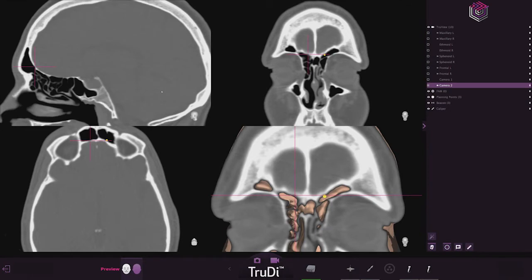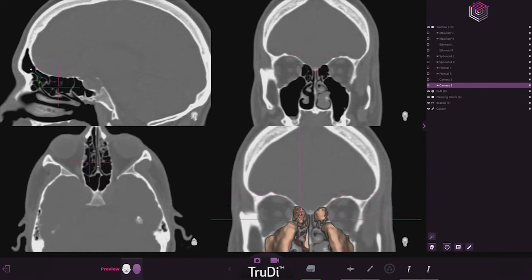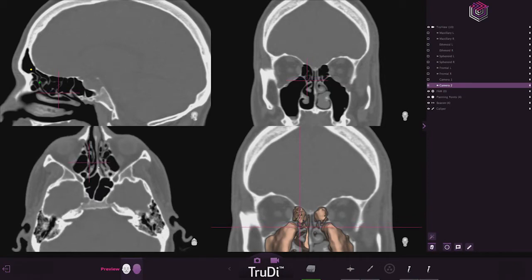And I'll just scroll through this. A little bit more to get exactly where I want to be. Okay, and to me this looks like the path. It's a little serpentine, but that's probably where we want to be. The left sphenoid, I will tell you, is a little suspect for me. That septal deformity is going to make it a little more challenging. So I'll go ahead and map it out, but I would say better odds than not we won't wind up actually doing it.